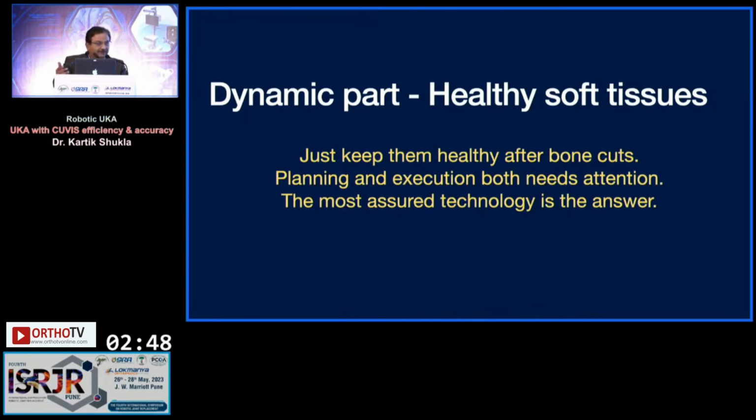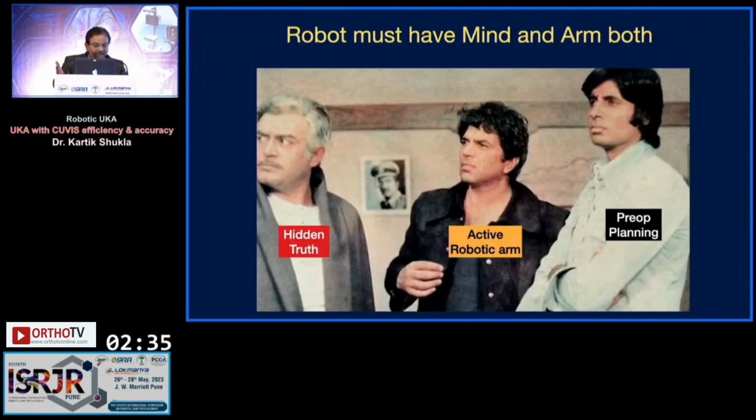In TKR, the concept may vary, you change your protocols. Here you don't need to change anything. Just keep them healthy after your bone cuts. Planning and execution both need attention in unicompartmental knee replacement, and the most assured technology is the answer.